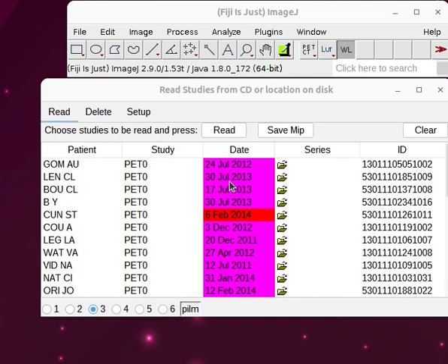What does that mean? The problem came up once that a resident, instead of reporting today's study, picked up an old study and reported on the old study. Not only did it waste his time, but the patient didn't get his report. Fortunately, they caught the mistake very quickly, but they came to me and said, look, you've got to do something about this. This can't happen.